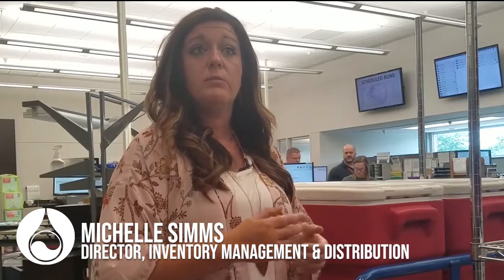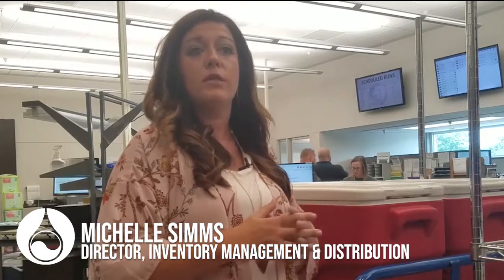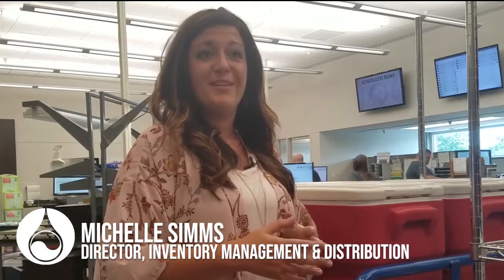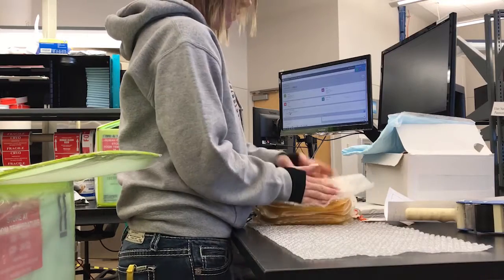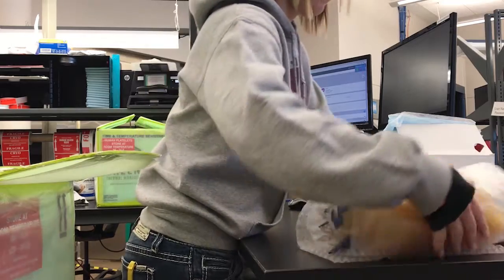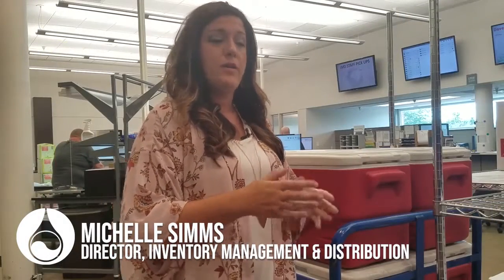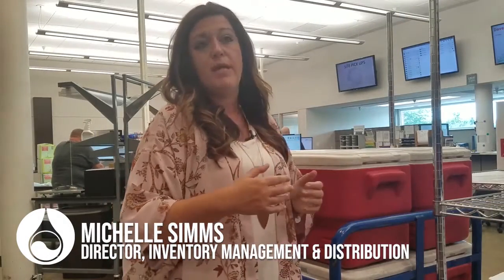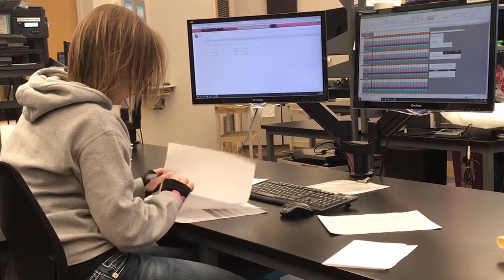Hospitals will call and communicate via the telephone, as well as we have an online ordering system that's called Blood Hub. So Blood Hub is kind of unique in its own way. It's kind of as easy as if you were to order a pizza online, ordering what products are needed for that day or for the week, whatever the hospital is anticipating their usage to be, and then submitting it that way. So that order comes directly to the department and actually alarms us and dings to us when that order has been dropped into our location.